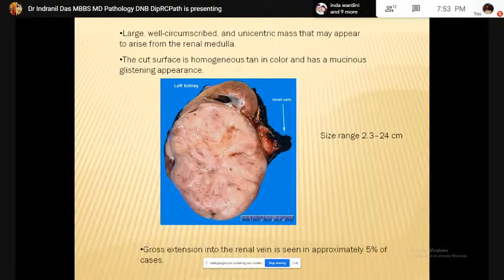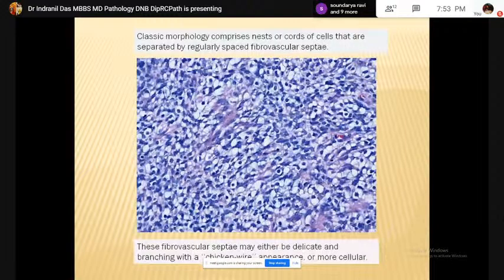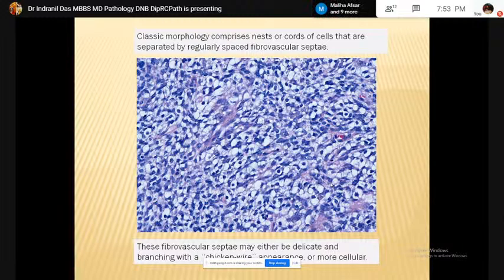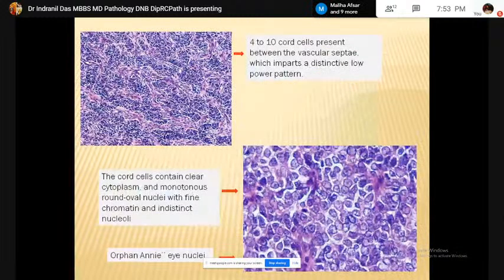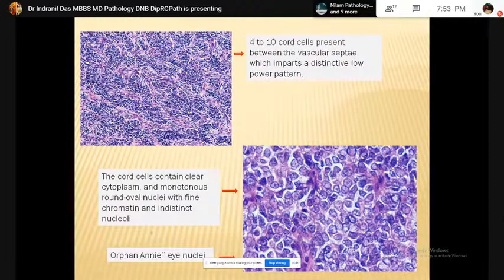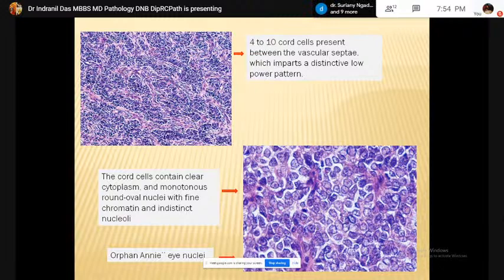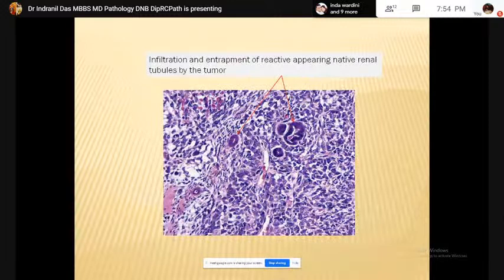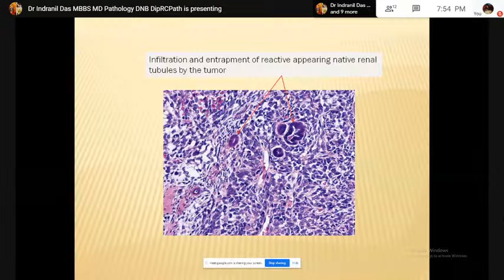The classic morphology of clear cell sarcoma comprises nests and cords of cells separated by regularly spaced fibrovascular septa. The fibrovascular septa may either be delicate with a branching chicken-wire-like appearance or more cellular. The cord cells show clear cytoplasm and monotonous round to oval nuclei with fine chromatin and indistinct nucleoli — this resembles the orphan Annie nuclei of papillary carcinoma of thyroid. Clear cell sarcoma may infiltrate into the surrounding normal kidney and entrap native tubules, which may be misinterpreted as epithelial component of Wilms tumor.